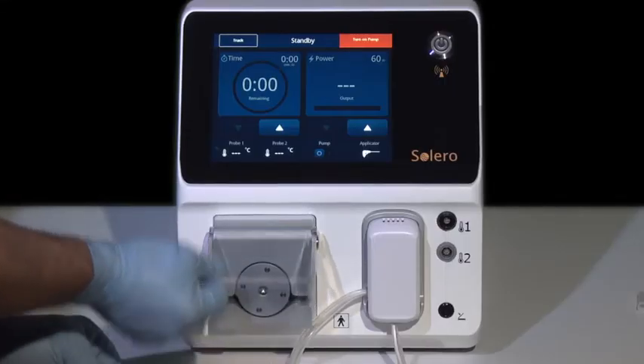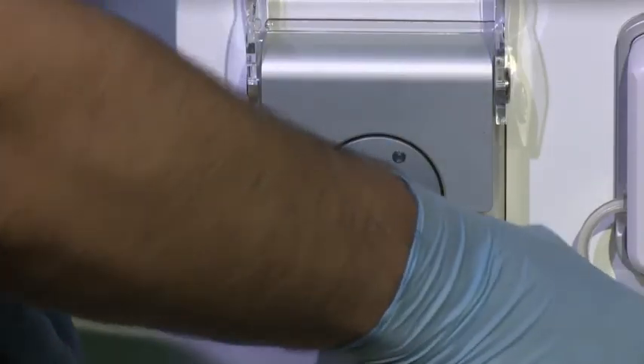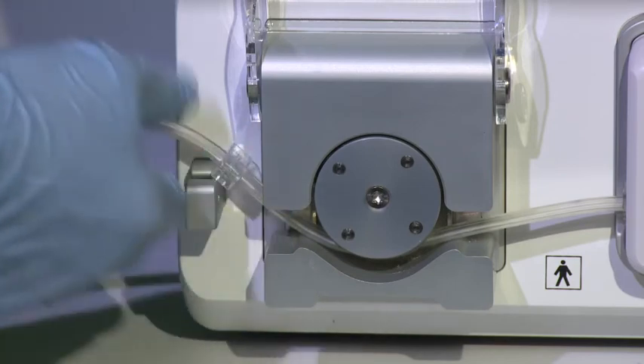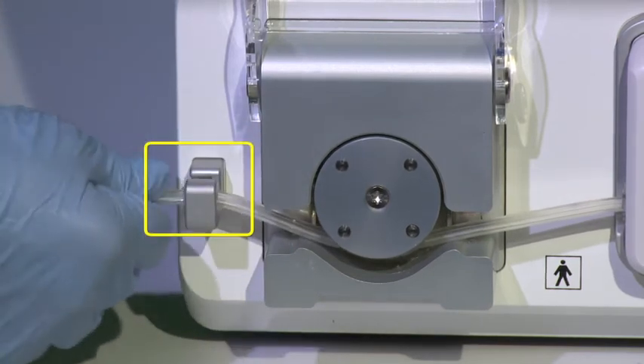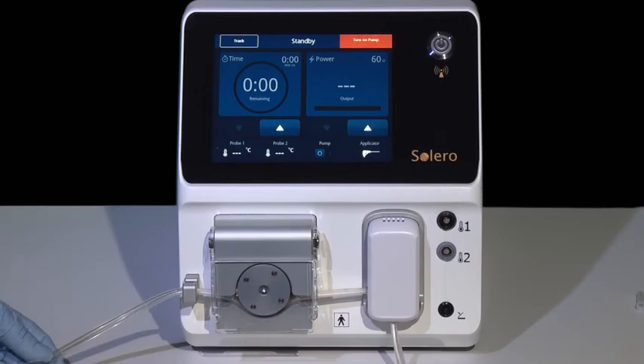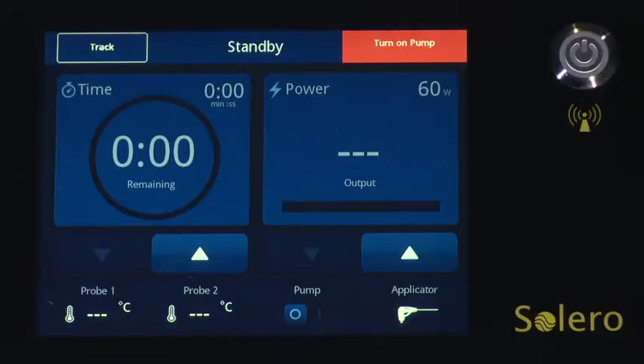Once the bag is spiked, open the pump housing cover and load the tubing set into the Solero generator pump. The pump clip should be loaded into the pump clip holder on the left side of the pump. Close the pump housing cover. Once the tubing is connected, press the pump on-off switch to turn on the pump.